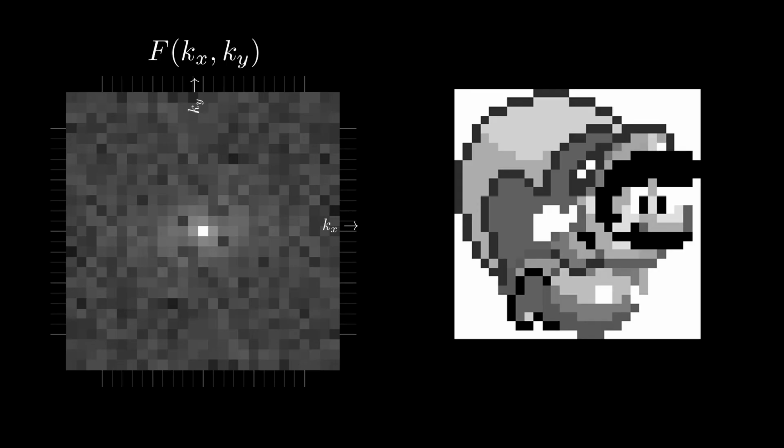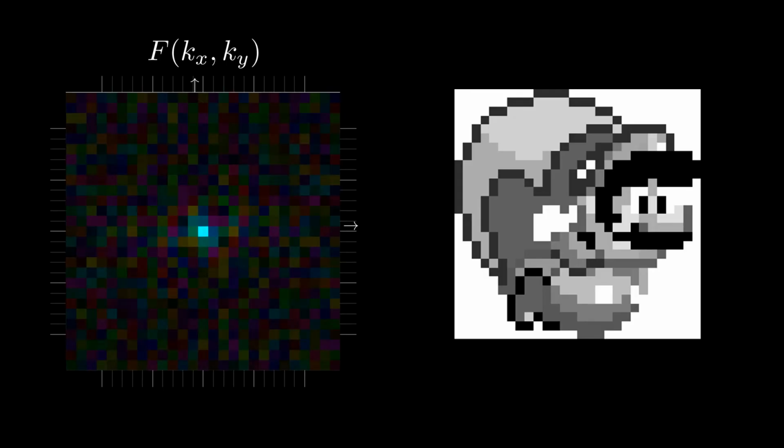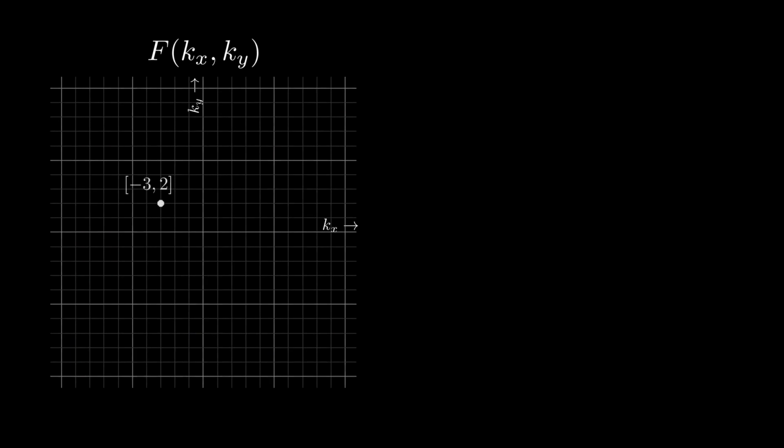Phase is generally ignored in these displays. If you wanted, you could color the points according to the respective phases, perhaps with a cyclical color scale, but little information is gained in doing this, except in really cool MRI sequences which are designed to leverage the extra information phase can provide. More on that in a later lecture. And now I'd like to pose a few questions to help you understand some of the details of kSpace better.